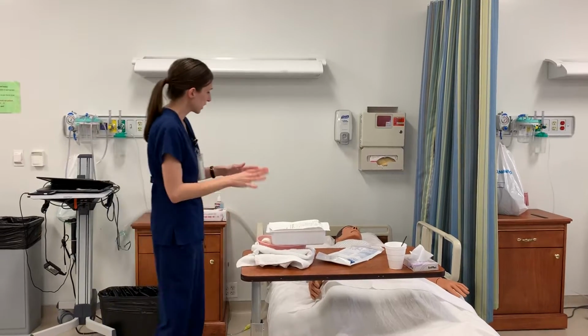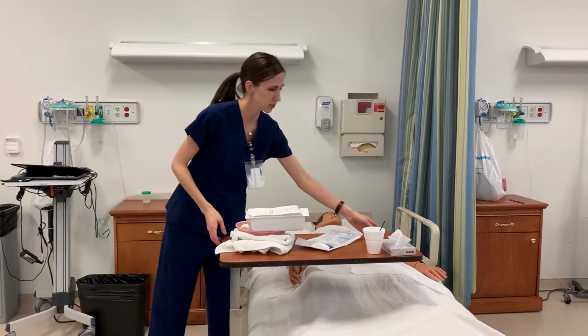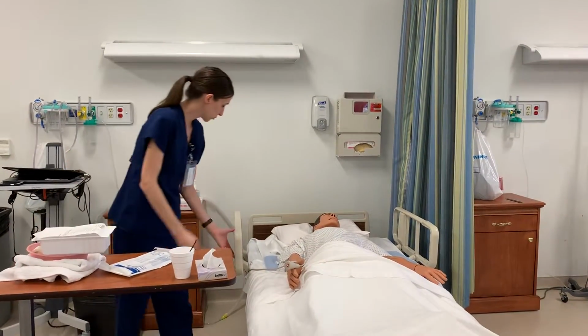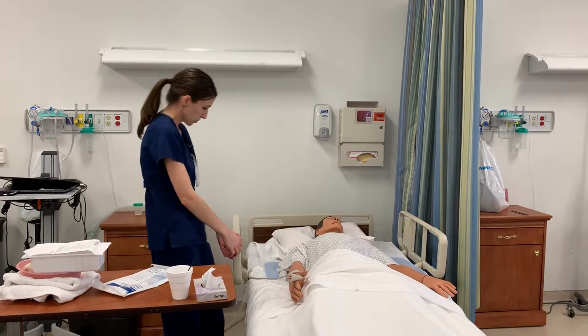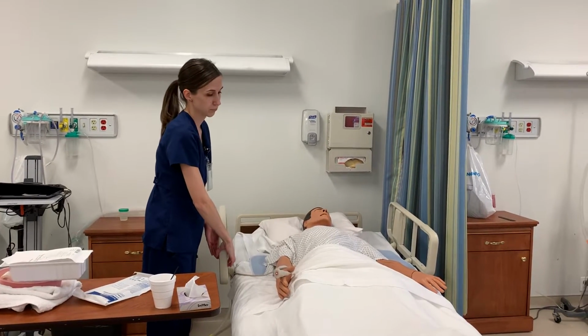So I will be adjusting your head of the bed as well as the height of the bed and proceeding. I've already done my hand hygiene. Just going to move this out of the way. I'm going to raise you up to the level of my hips. I'm also going to be raising your head of the bed up to a high Fowler's position.